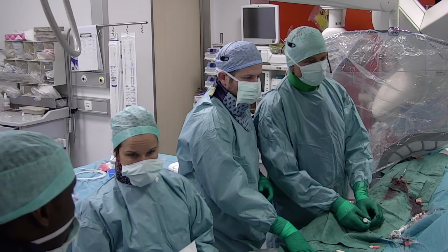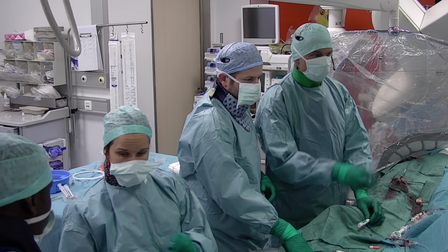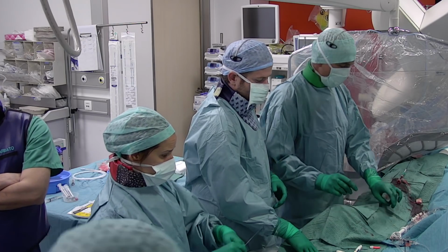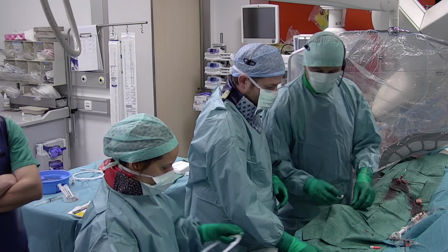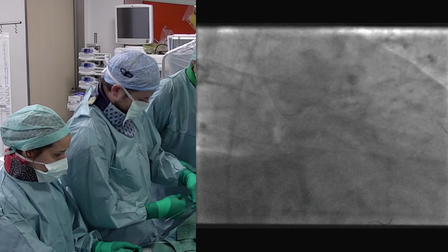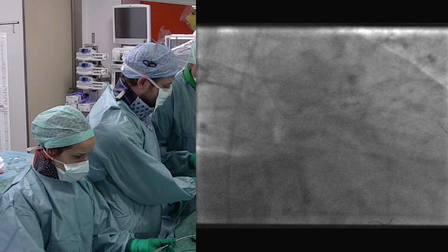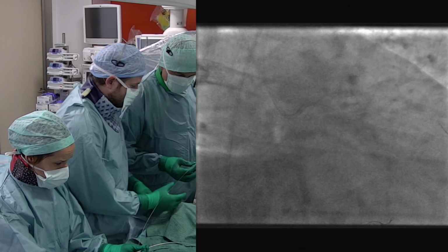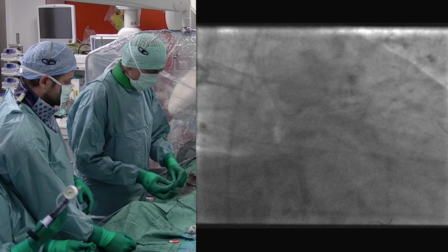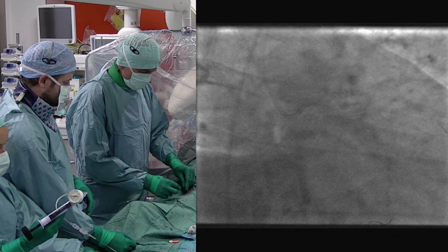If you agree, please push on the button. I think it's a good choice, Bernard, to optimize this stent dilation.